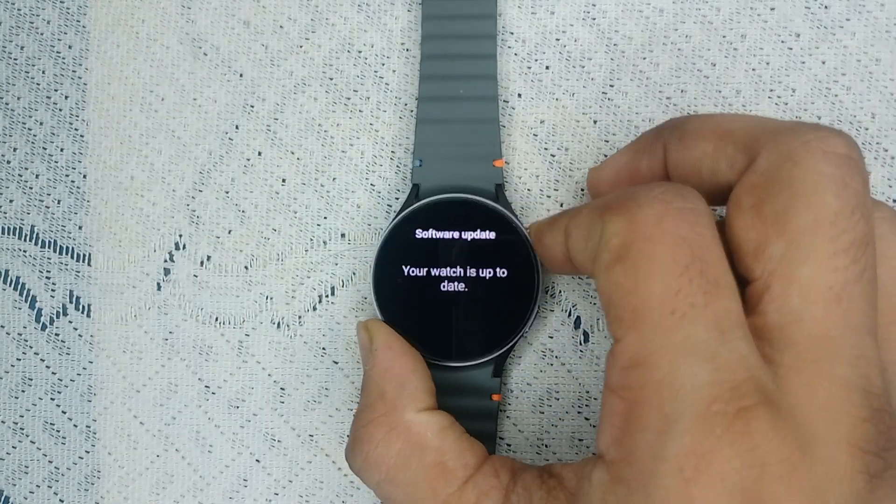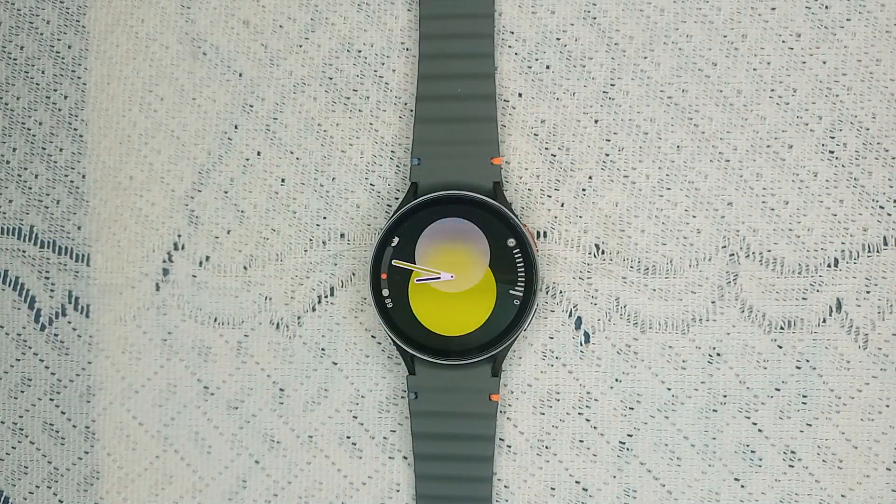Also check that your smartphone is updated, and that the Samsung Health Monitor app is also up to date. Once the app is installed, it will reflect in your Play Store and you can go to the Play Store and update it from there.